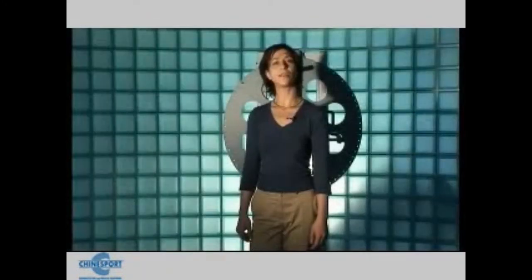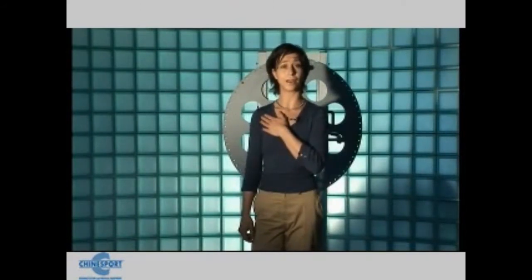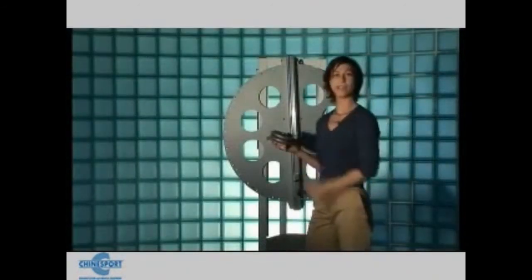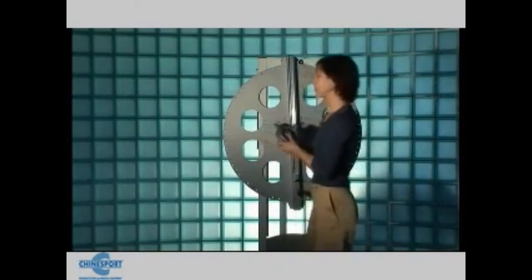The patient regulates the two components of the movement so that it does not force the joint rigidity. Obviously, it is an exercise that does not set a precise objective, and unfortunately, it stimulates the patient to activate some compensations. These compensations are difficult to avoid because the movement is rapid and spontaneous. We can reduce the effort required by applying a counterweight that lifts the arm.